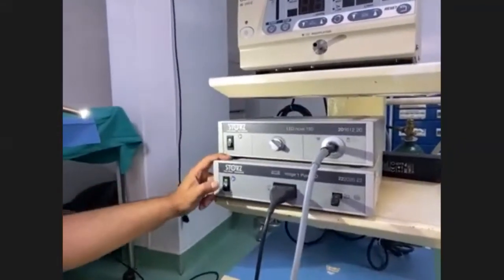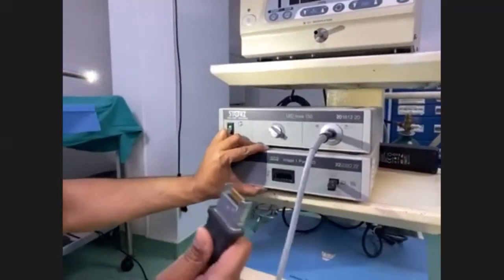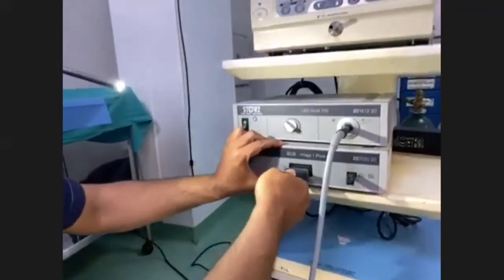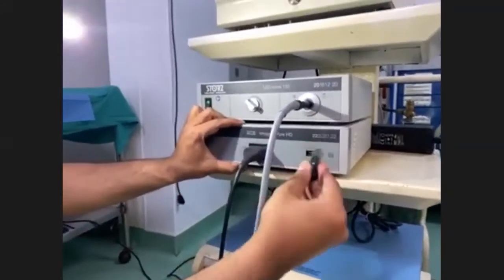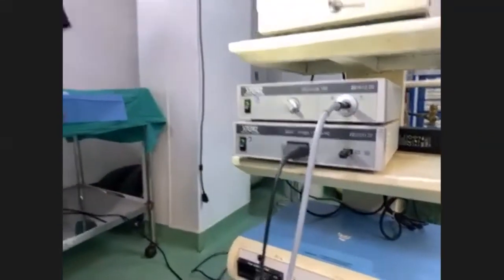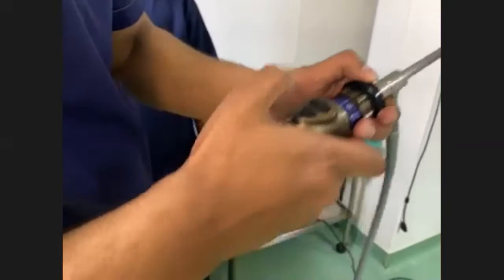This has got a switch on and off button. Then this is basically the camera head knob, which is attached into this socket. And then we have a USB recording system as well. We attach any USB over here and we can record our system from this button. If you keep this button pressed for a while, it will start recording. Okay? You can see record video here.